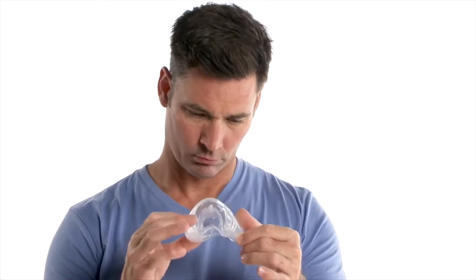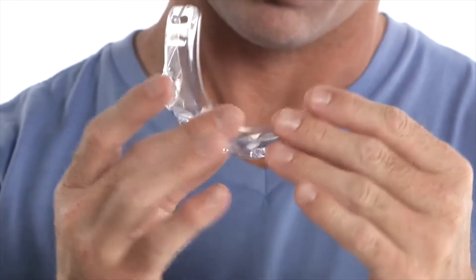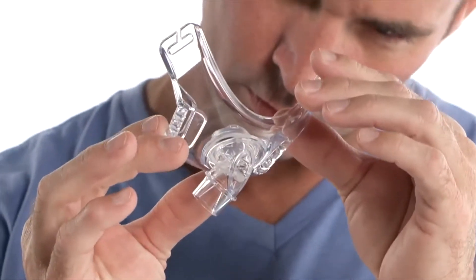Be sure to inspect your mask and tubing for damage or wear, such as cracking or tears. Discard and replace parts as necessary.